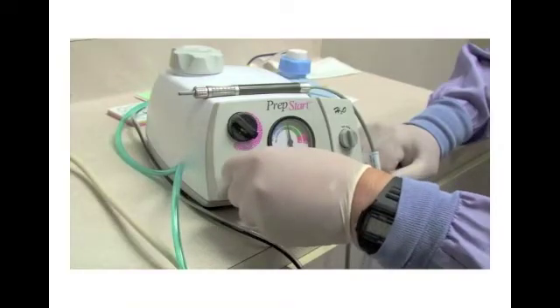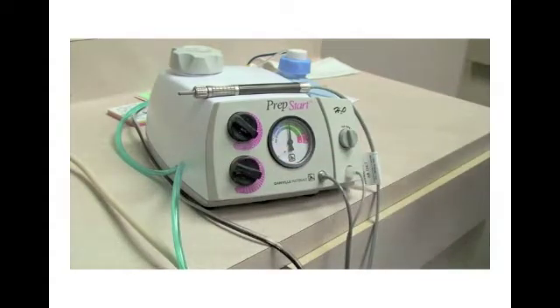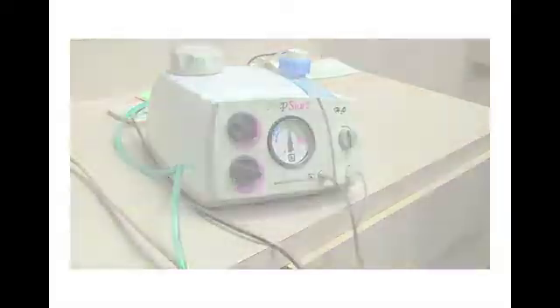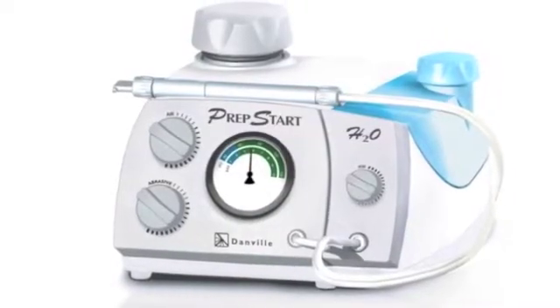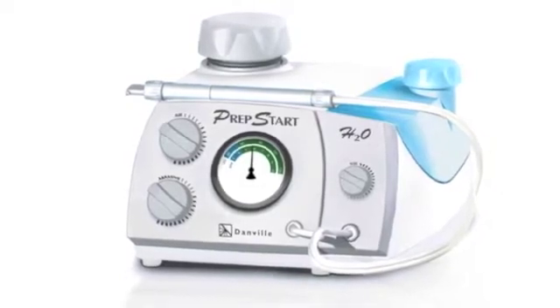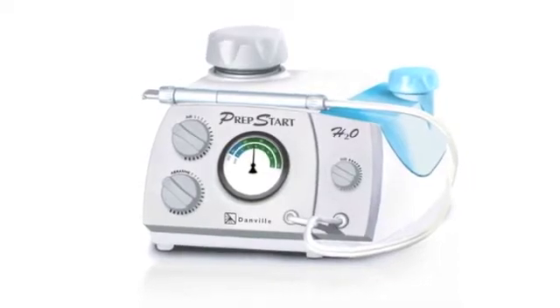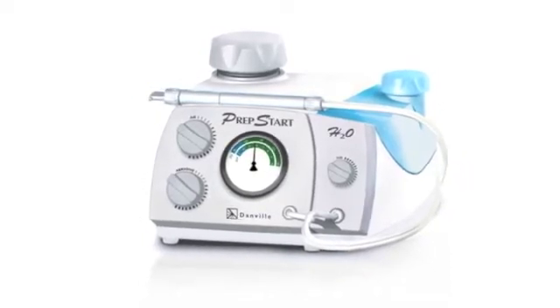The PrepStart's small footprint and simple design only requires a connection to your currently available air supply. The water and aluminum oxide is contained in their own independent reservoir. You easily adjust the air pressure, water, and powder flow according to the clinical situation. The ideal starting pressure to cut enamel is between 80 and 100 psi, and that is typically the cycle pressure supplied by your office compressor.